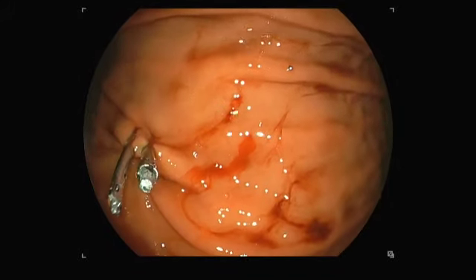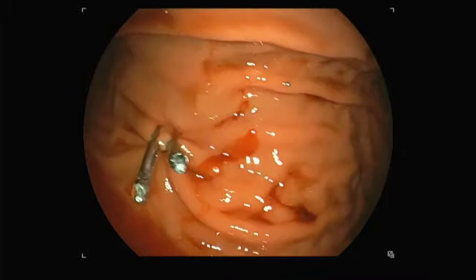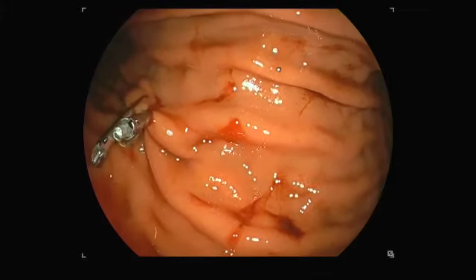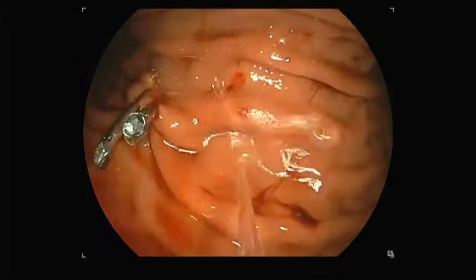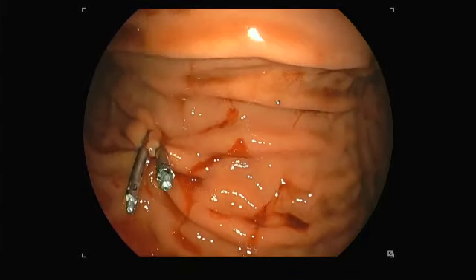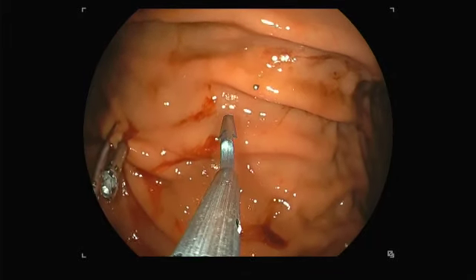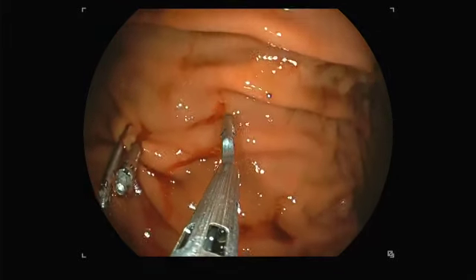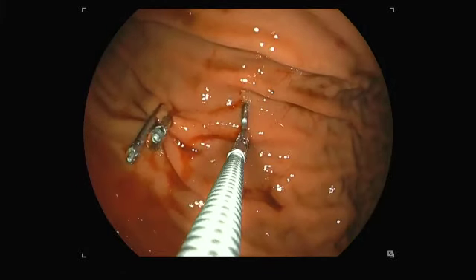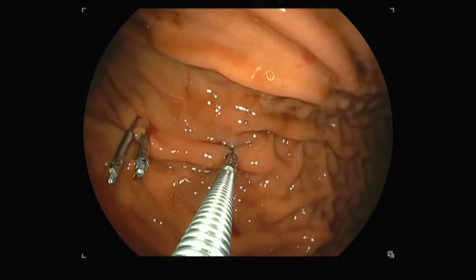the bleeding stops. The bleeding actually stopped, but there was another vessel that opened up adjacent to that. You can see right now there is some ooze, and we had to manage that. And we wanted to confirm that it was actually going to continue to bleed before applying a clip. And we felt that instead of applying it directly on the bleeding spot, we wanted to apply a little bit distally so that we could occlude the feeding vessel and stop the bleeding.